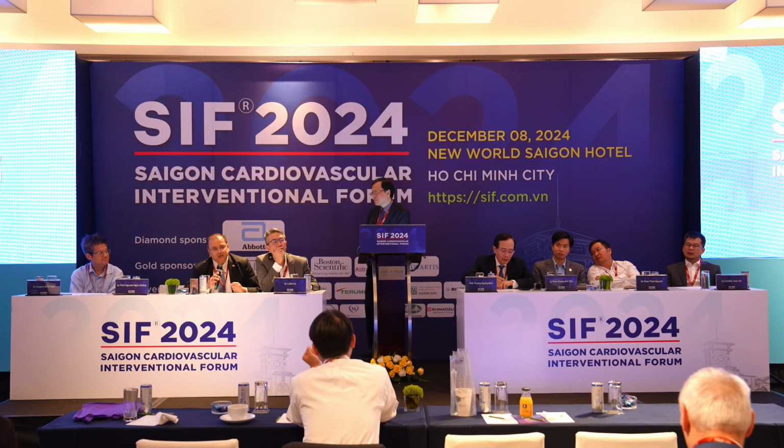And what's interesting is what you mentioned just now. Just by twirling the wire, you managed to take out the burr. But most of the time, I need a balloon. And like what Professor Eugene was saying, the other option is a mother and child. So you must be well versed in where to cut and how to put your guide extension right to the burr, and then try to pull out. Most of the time, it will work. Just a comment. Thank you. Oh, thank you, Dr. Wu.